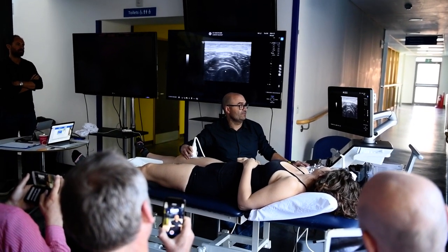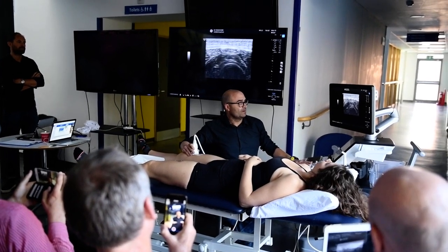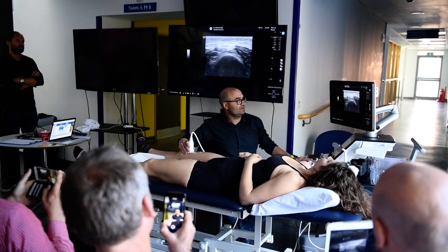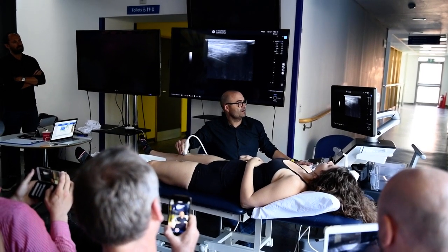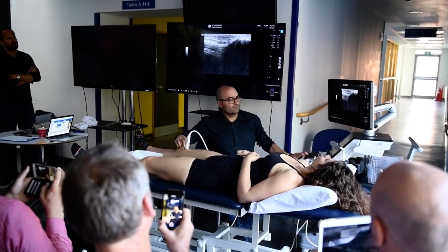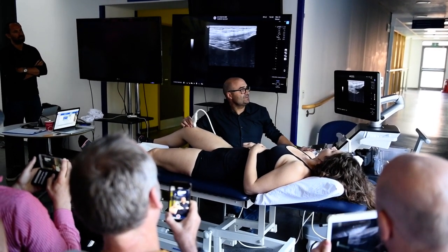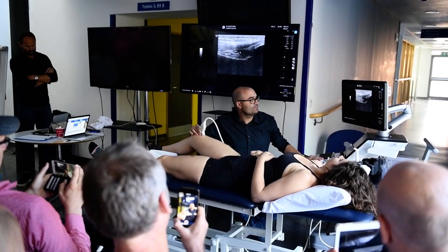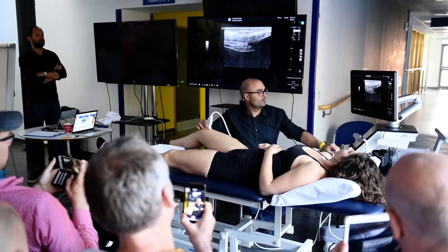And the femur here. Look at all the contributions of the vastus and rectus femoris to the quadricipital tendon, as much as we go distal. And now here we find — flex a little bit — the quadricipital tendon and a little bit of liquid in the suprapatellar recess.